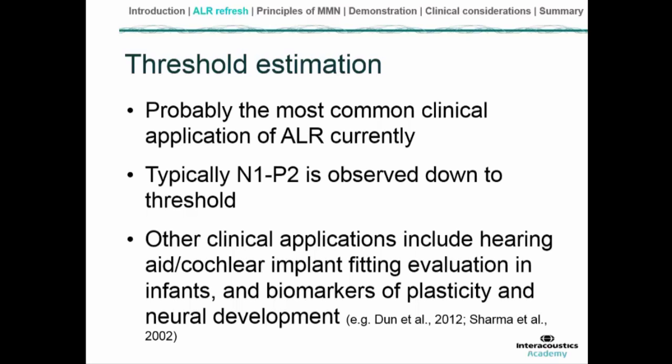There are other clinical applications in relatively recent years. There's been increasing research as well as clinical interest in the use of the ALR to evaluate the success or otherwise of a hearing aid or cochlear implant fitting. Other uses might be in the research domain as biomarkers of neuroplasticity and learning.